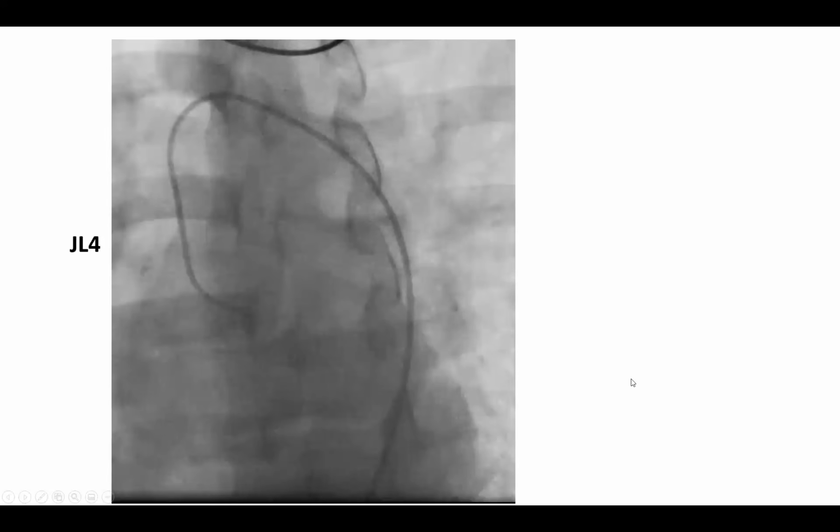I want to keep going for about 10 minutes, okay? I hope you can stay with me here. I will show some really important tips for diagnostic as well as interventional, more advanced fellows. So this is a basic idea. Unfortunately, I quiz fellows on that, and they don't often give me the right answer.